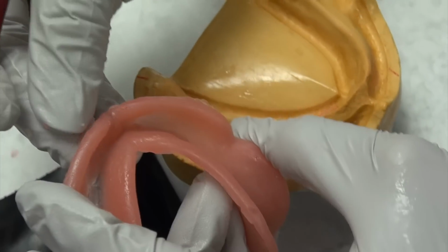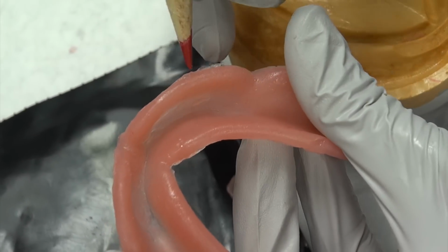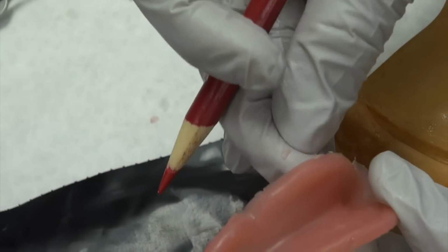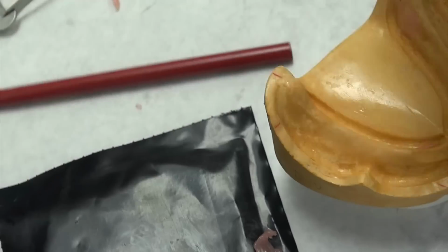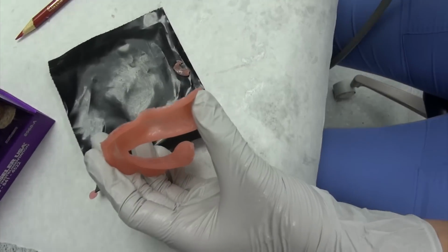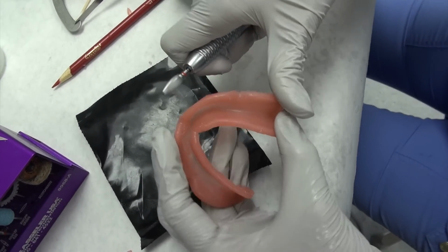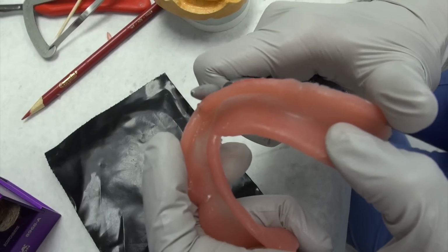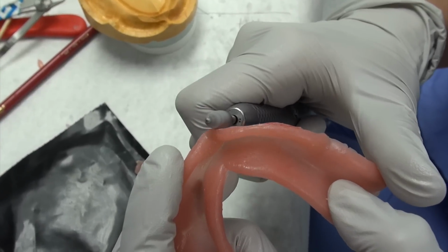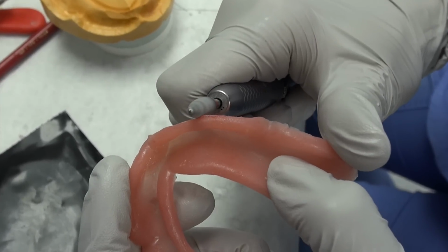So using that cotton, we'll get it nice and smooth like that, okay? Just gonna rub that little, right, so we can see where we're coming up to. Okay. So now, are you still there? Zoom in. So holding it upright, you're trying to get that very edge. See where the line is? Or zoomed into that point?